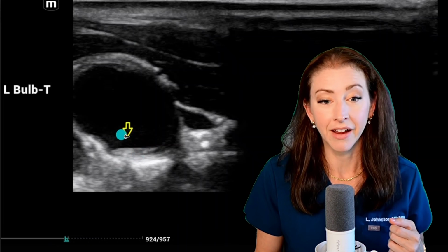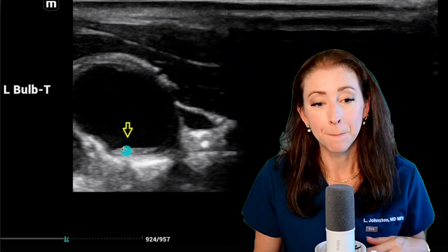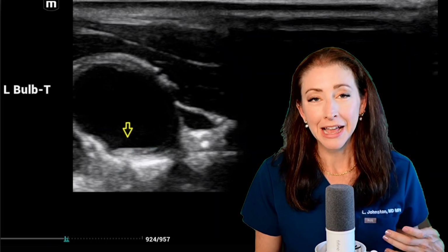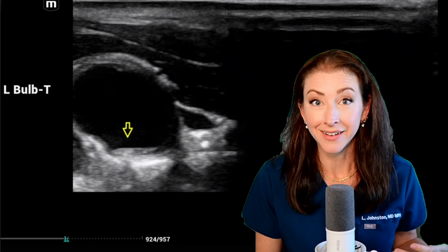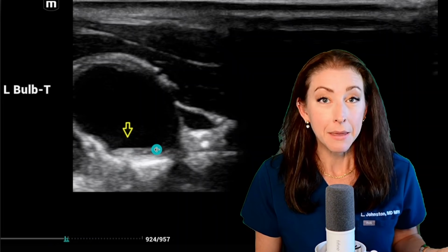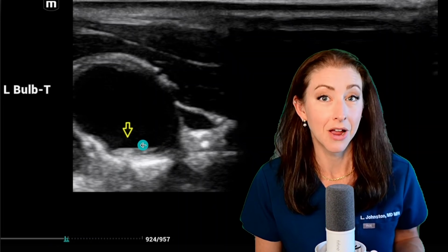There's plenty of flow here, right? This whole black thing is wide open. There's no narrowing. There's no blockage or stenosis. But this is the beginnings of early change. This is the beginning of plaque formation. Will it be a problem in the next 10 years? Probably not. 20 years? Probably not. But if left unchecked for 30, 40, 50 years, maybe that is going to be the thing that becomes a problem. What if this is the same process that's happening in much smaller arteries around my heart?